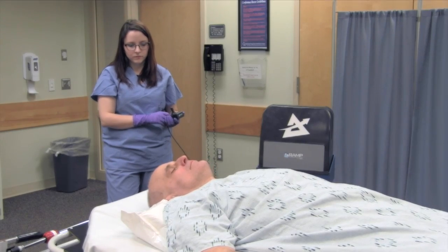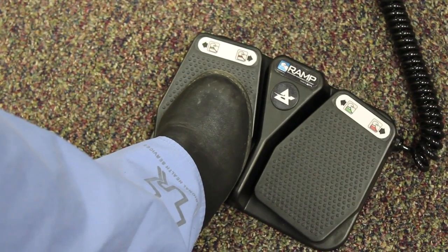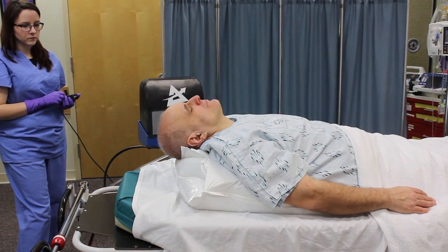When using the hands-free solution, toggle between each foot pedal in a controlled fashion to also actively inflate or deflate each chamber.